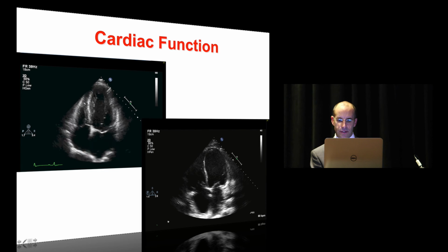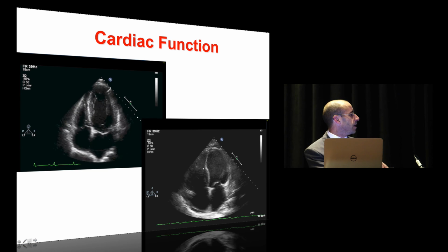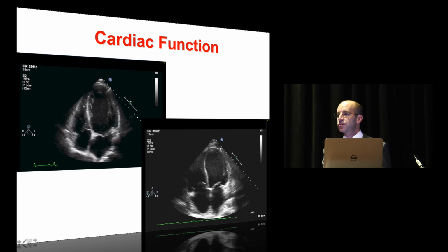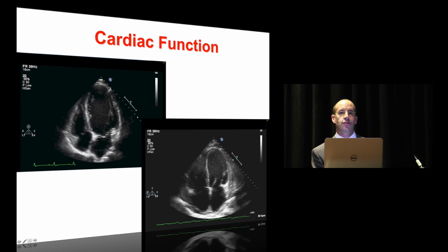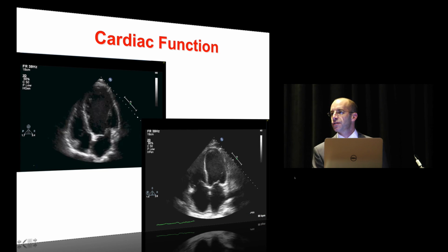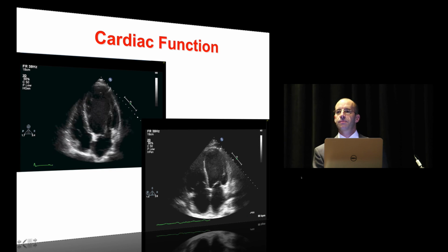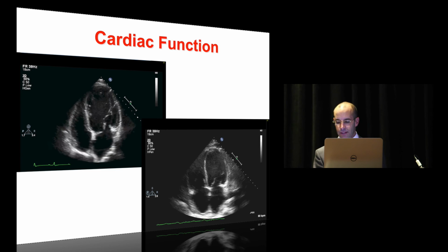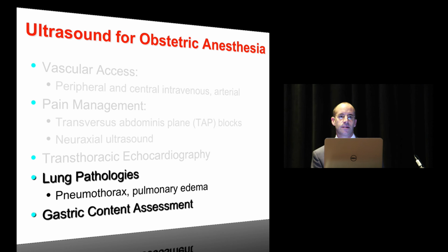And if you contrast that with that myocardium, it is global function, so it seems like everything's affected. You would not make that assessment of global function just on one view, but if you combine it with other views, you can see it's just contracting extremely poorly. So if you saw that in the setting of a postpartum hypotension, you would suspect a peripartum cardiomyopathy. So not that crazy science to do, and it's sort of fun to see the images.